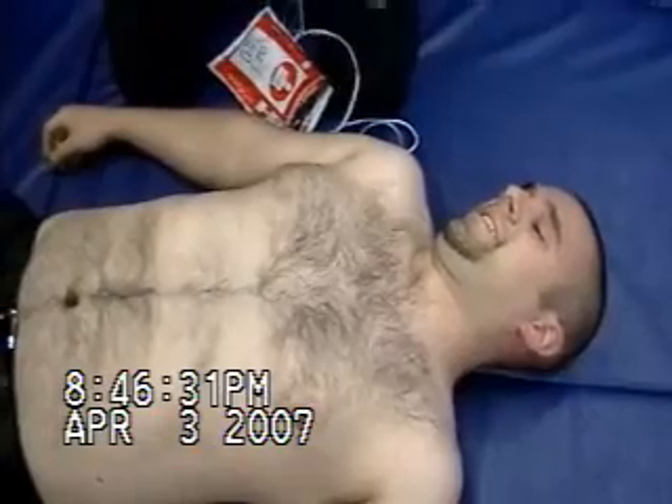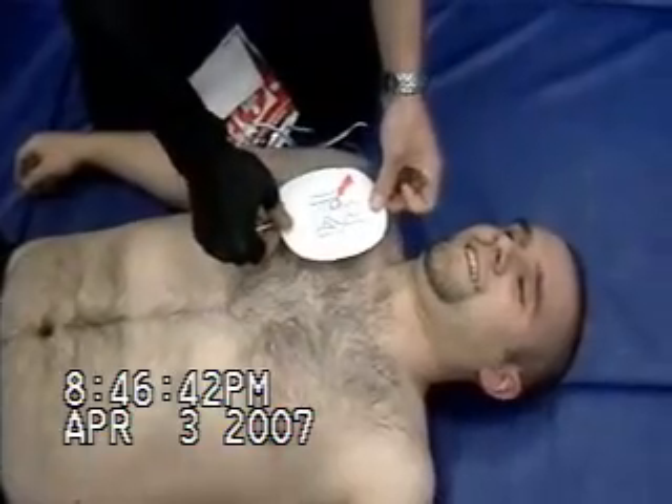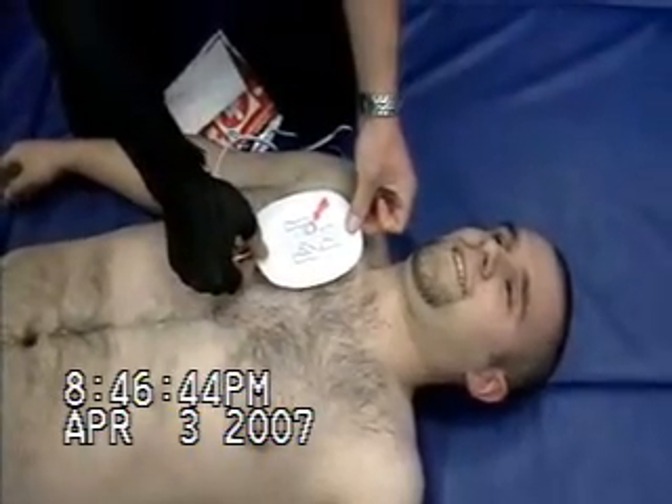So where are we going to go? Where would you like it removed? It's going to be right where it was supposed to go. It's going to hurt. So we have two pads, so if one doesn't work... Make sure you go against the hair grain. Straight down. Now we're going to place it — a little bit more right there, right there. Now really put it down good.